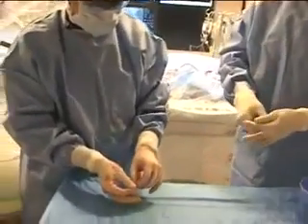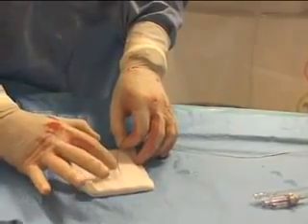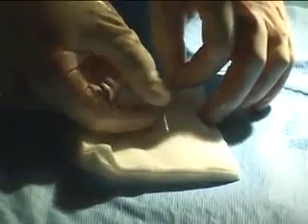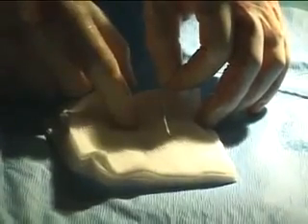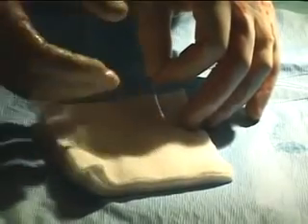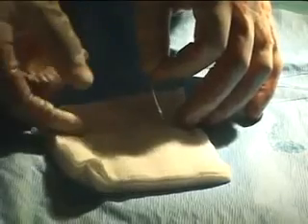This is the stent that will go in the proximal part of the artery. You can see the stent material, which is a stainless steel or a cobalt chromium alloy — the two different stents we now use in coronaries. The stent is crimped on a balloon; you can't really appreciate the balloon because it's uninflated. We'll put the stent in the artery over the wire, inflate the balloon to deploy the stent into the wall of the vessel, then deflate and pull the balloon out, leaving the stent behind.